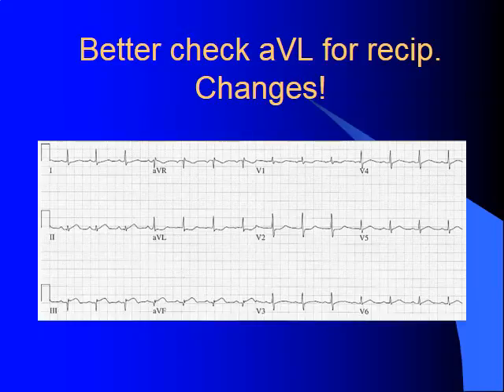Looking at just a quick glance at this EKG, especially from beginners at EKG interpretation, it is very easy to miss the subtle ST elevation in leads 2, 3, and AVF. Noting that the ST segment is just above the isoelectric line, looks like about 2 to 3 millimeters in 3 and AVF, and then a couple millimeters in lead 2.